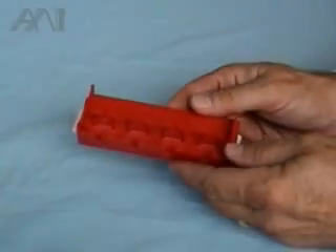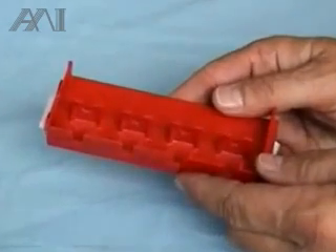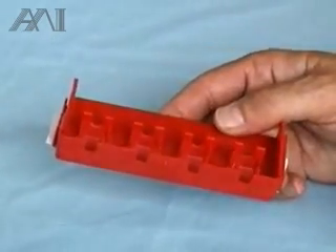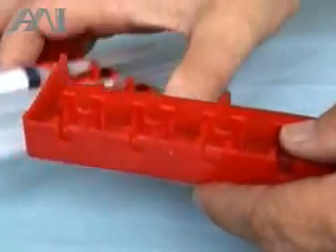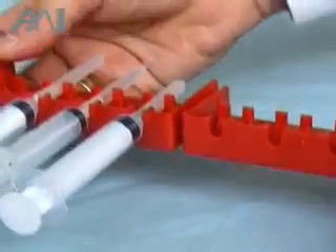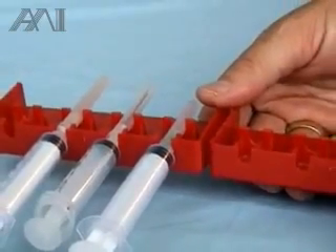I would like to present our syringe-needle recapper exchanger, which is a rack of four slots for four needles and syringes. Our rack system can be connected together for a capacity of eight syringes and needles in this instance.